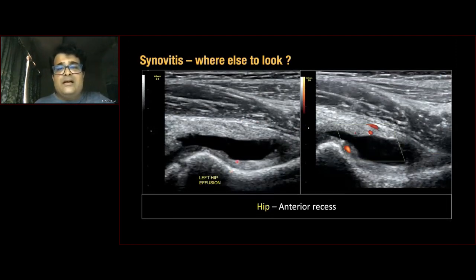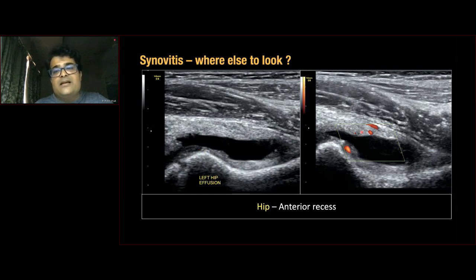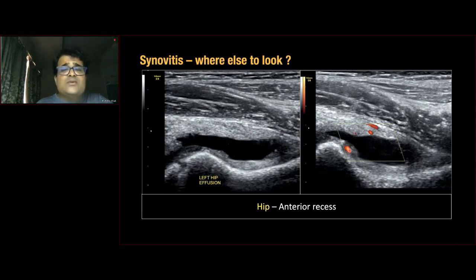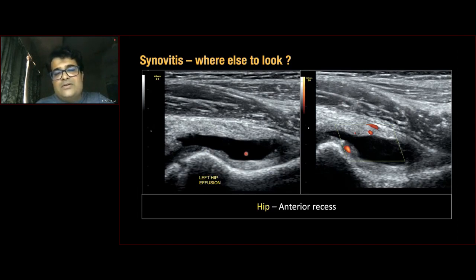For the hip, look at the anterior joint recess — many of us are familiar with this from pediatric hip scanning. Shown here is the smooth cortex of the femoral neck with some synovial hypertrophy and thickened synovium with mild hyperemia. This patient had synovitis of the hip of undetermined etiology — no turbidity of fluid to suggest obvious infection at this point.